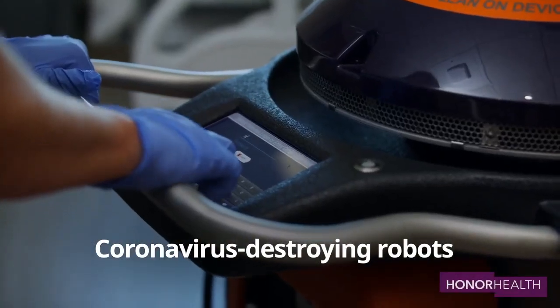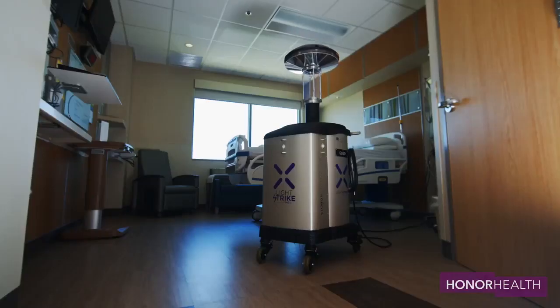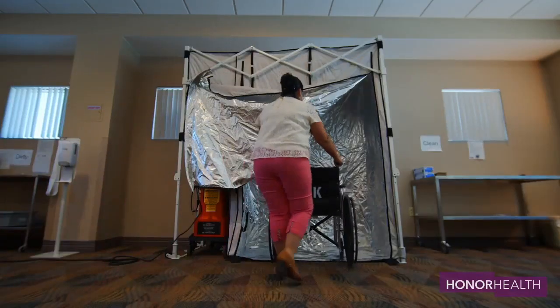The robot is called Light Strike, and it was created by a company called Xenex. It can destroy the coronavirus in just two minutes. HonorHealth has 32 of these robots throughout its five hospitals in Arizona — it's actually one of the largest fleets in the country.